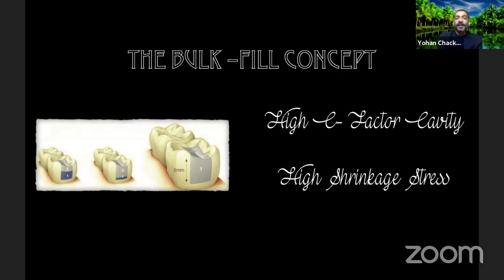Then came the bulk fill concept, which means let me introduce a composite that can be cured up to at least 5 millimeters in depth. And this is just a product catalog picture that I took. What I want you to train your attention to is the cavity design. The cavity design in all three situations is a large box, and the top is a 90 degree butt joint at the occlusal level.